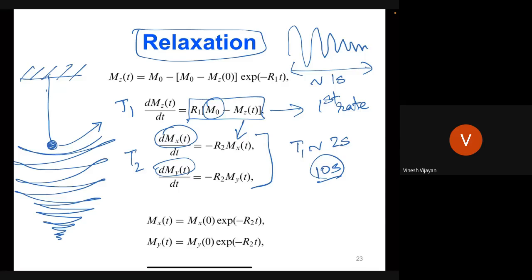Sir, now it is clear that we can apply a 90 degree or 180 degree RF frequency. It's not RF frequency, it's called an RF pulse. Can we apply RF frequency gradually changing from 90 degree to 180 degrees? This is a fantastic question. And unfortunately, we don't have the time to answer it, largely because there are definitely pulses that can work in such a fashion. And in fact, there are pulses that work as a 90 degree in a certain frequency range and some other degree pulse in some other frequency range.